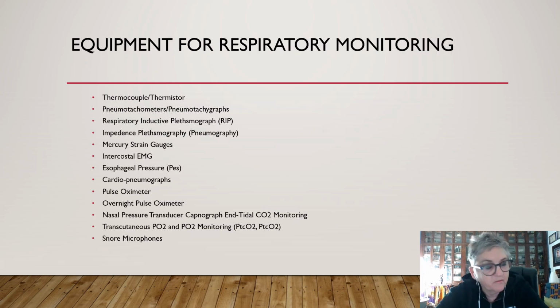The first objective we're going to work on is explain the equipment needed and the techniques to measure airflow during sleep studies. Here on this slide, I've made a list of different pieces of equipment that we can use to measure airflow. We're going to cover each one in a little bit of depth. We don't use all of these during a sleep test, but we can use what's recommended by the AASM.